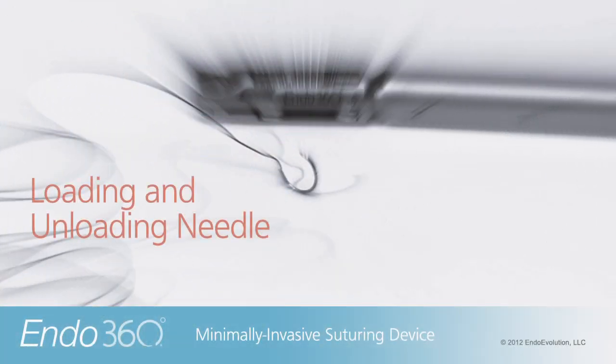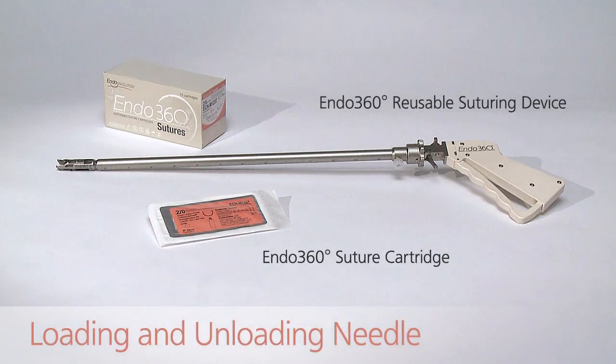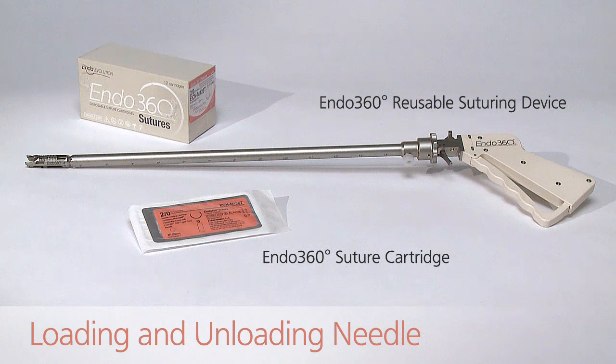This video will illustrate, demonstrate, and describe loading and unloading the needle from the EndoEvolution Endo360 Minimally Invasive Suturing Device. The needle, suture, and suture loading cartridge are all contained within a standard sterile package.